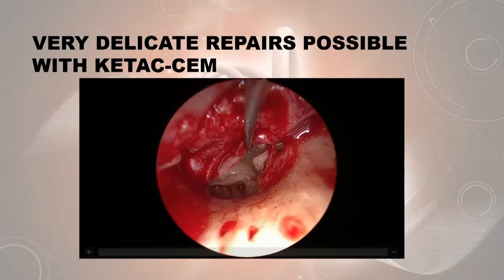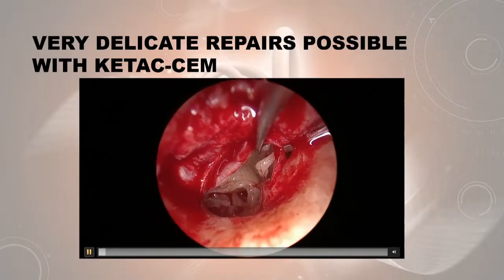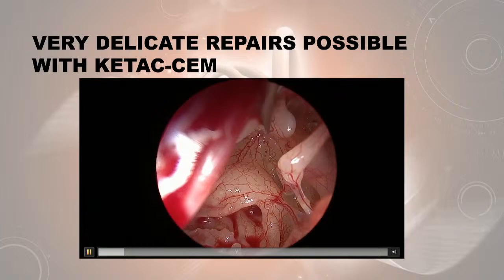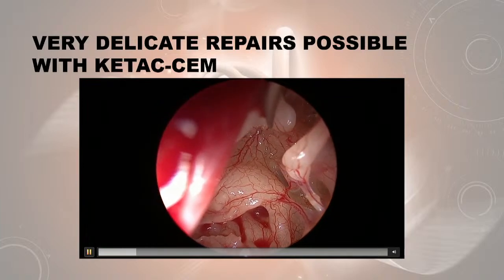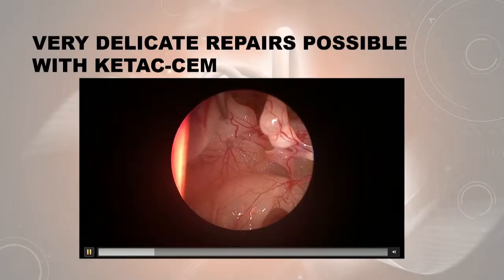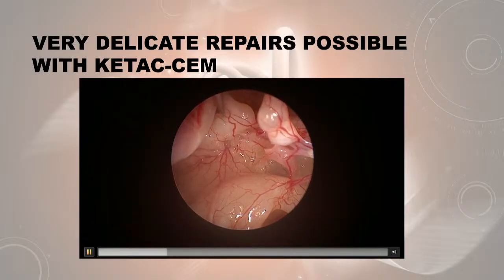But what I like about this is here we've got a congenital small air-bone gap, not a massive thing, and I opened up. This is the endoscope view, obviously a more accurate view, and there you can see there's just no connection to the stapes head. The incus is there. We've got the tendon in place. We'll show it to you from another angle, and a mobile stapes, just a little gap.